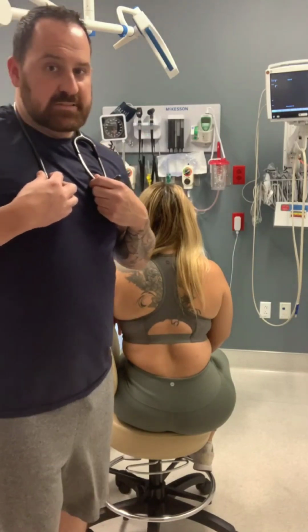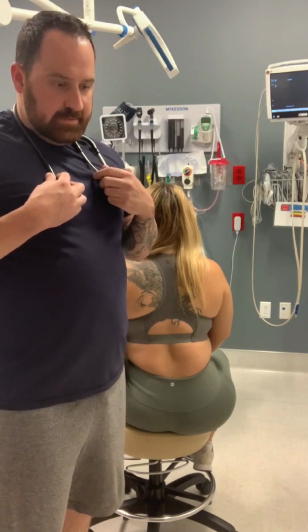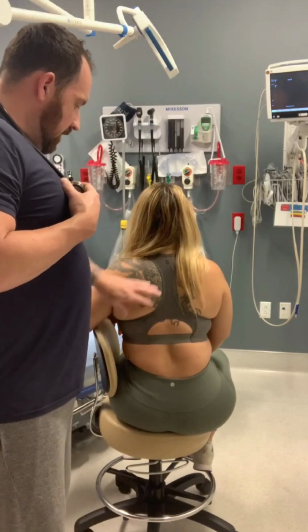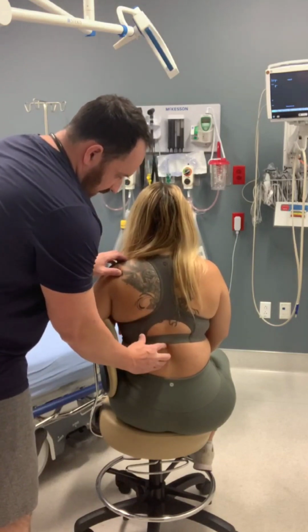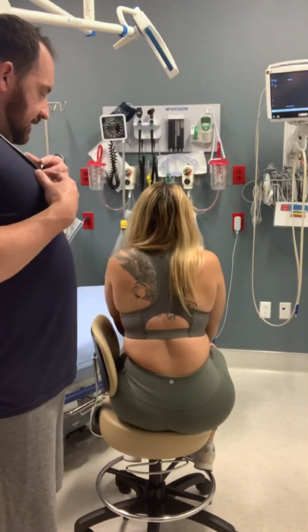All right, so lung sounds are clear in all 8 areas. There's no adventitious lung sounds. There's no wheezing, no rhonchi, no rales. It is a normal finding for the posterior back. And I am right now also going to palpate your spine. Any tenderness or pain when I do this? No. Okay, the spine is in its correct alignment.